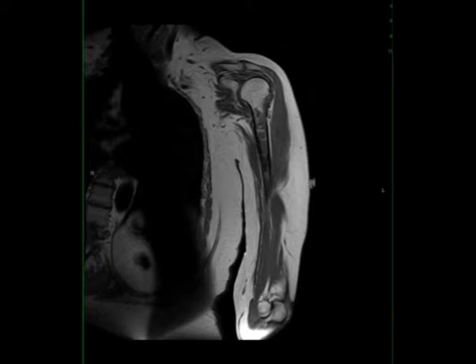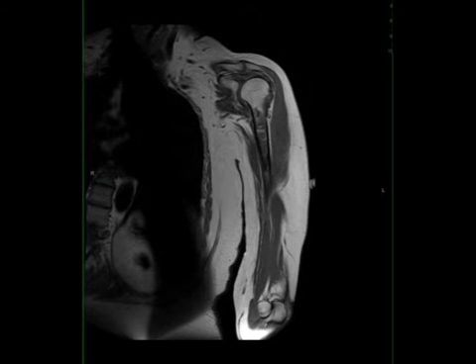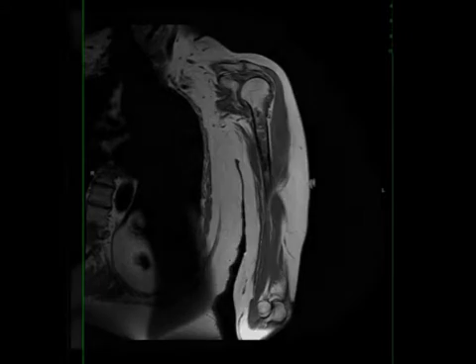This is a 58-year-old female with a history of chronic left arm pain. The images demonstrate a T1 hypo-intense, STIR-heterogeneously hyper-intense lesion centered within the medullary cavity of the left humeral diaphysis.